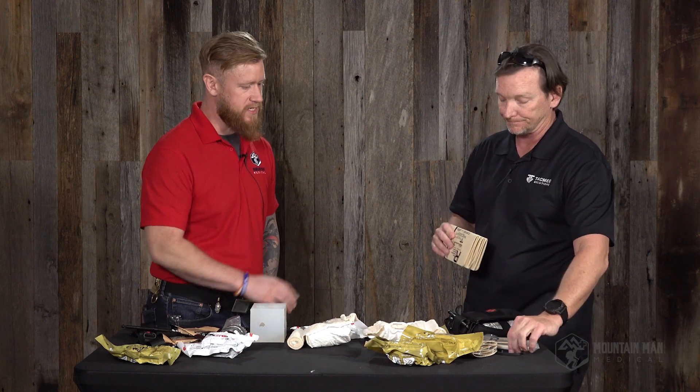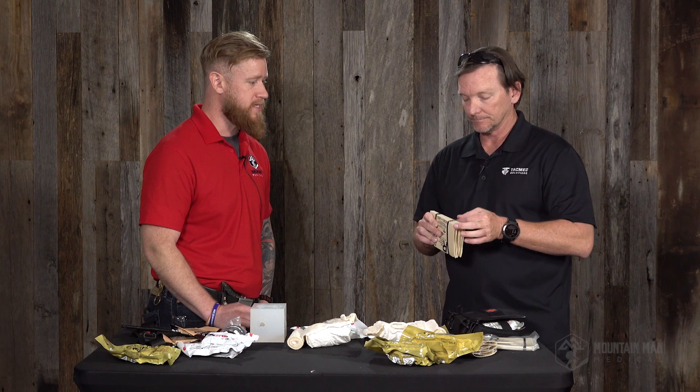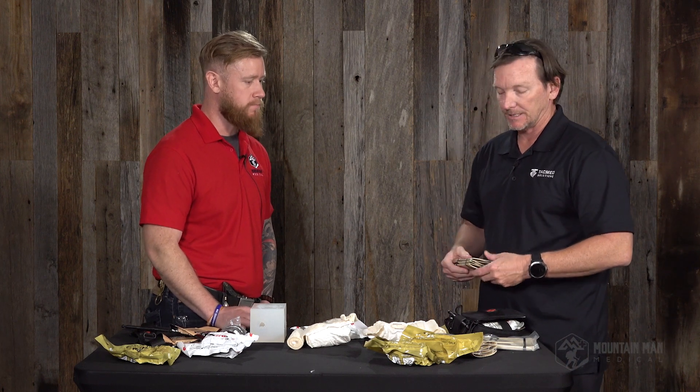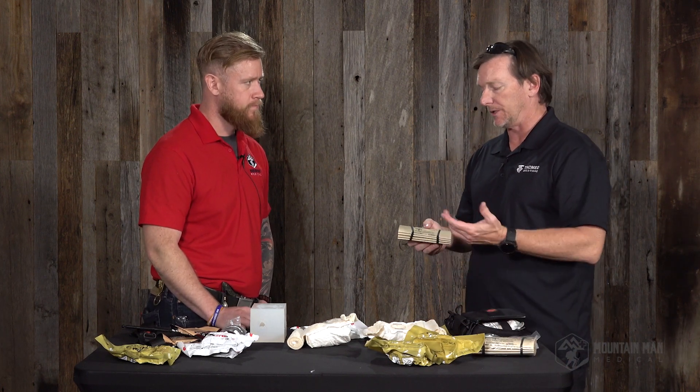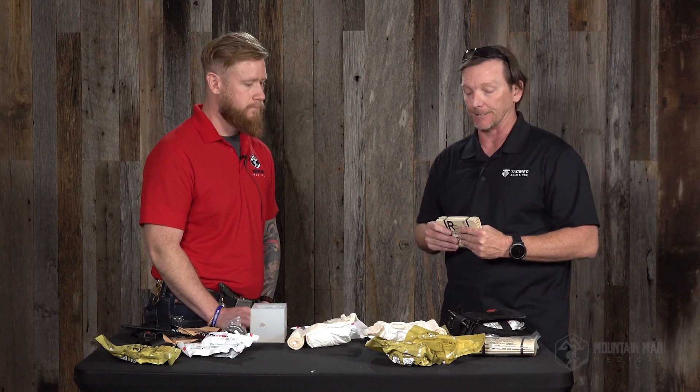Just the packability is one of the big things, because those aluminum splints tend to be a little more bulky and take up quite a bit of extra room. They have folded ones and flat ones and they're still great products. All we did was take the padding off, save you the space and weight, and let you pad with what you want, when you want, where you want.